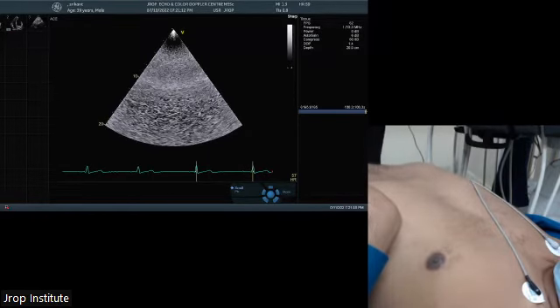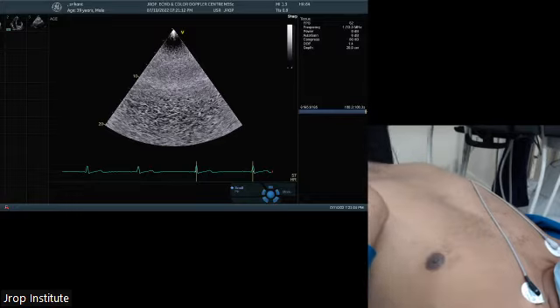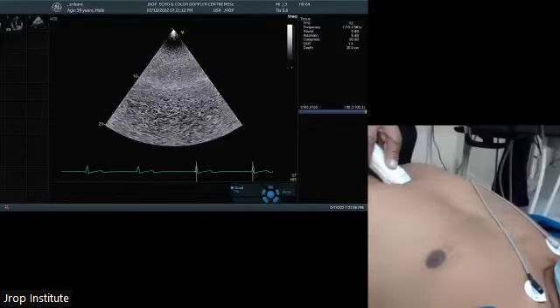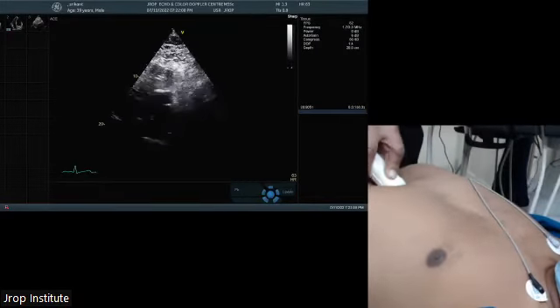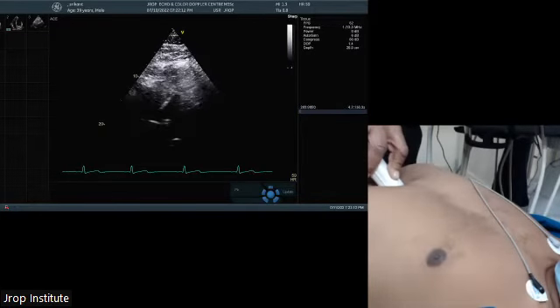Sir, Anuj, go ahead. In case of ASD and VSD, meaning a defect across the septum, how can we have a view with a Doppler angulation parallel to the probe? Subcostal window. So in subcostal, how can we have the ASD, I mean, the interatrial septum parallel to the vector? Interatrial septum is parallel.